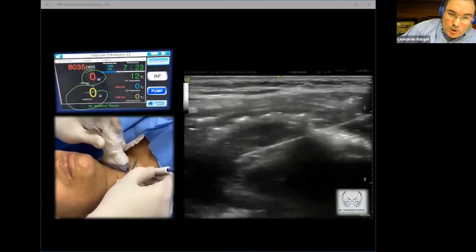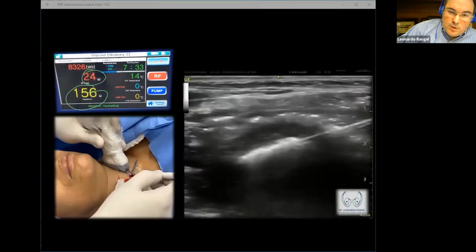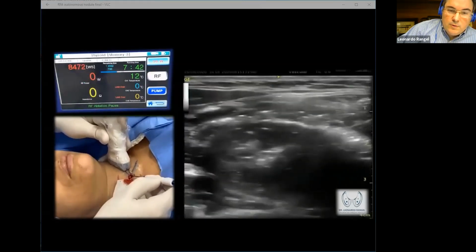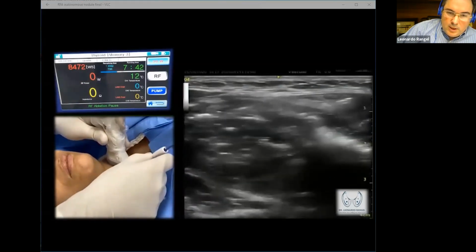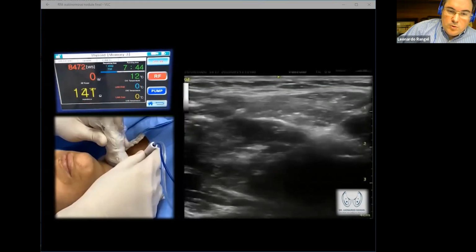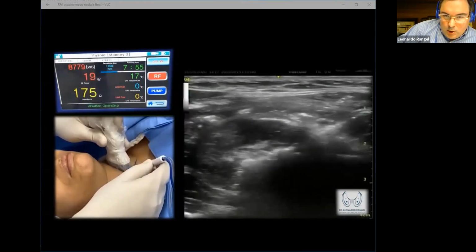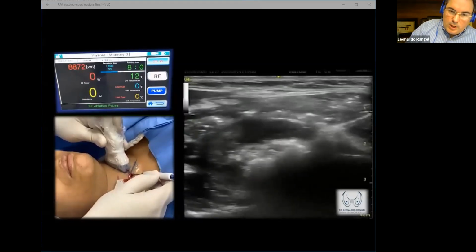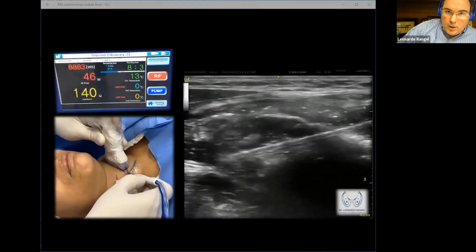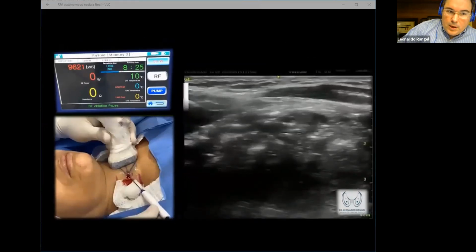And another thing, this being an autonomous nodule, we have two main goals while treating it. We definitely need a reduction of the volume, but we also seek the treatment of the function of the thyroid. So as we are treating, we are trying to leave as little margin as possible of being unablated. And when we finish here, we will use another technique besides the move and shot technique of the radiofrequency ablation per se, but we also use some other techniques like hydrodissection and also vascular ablation.